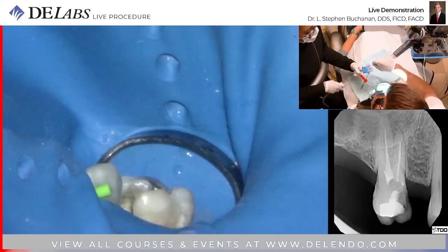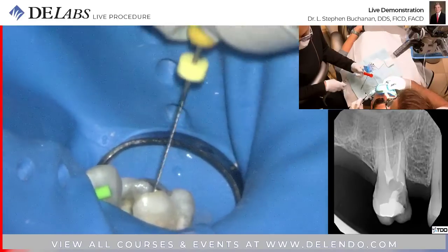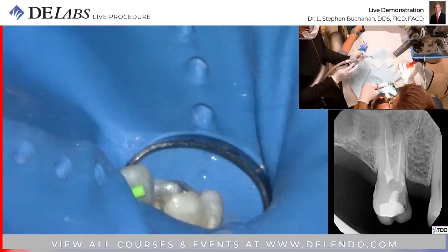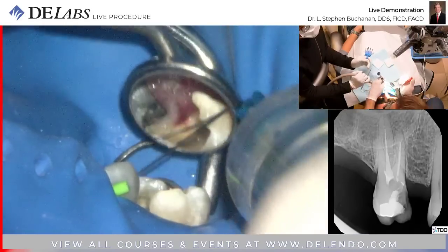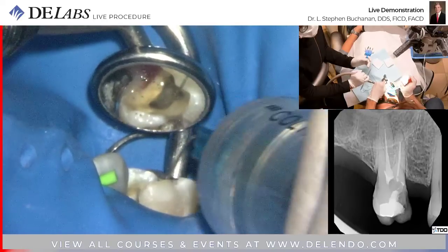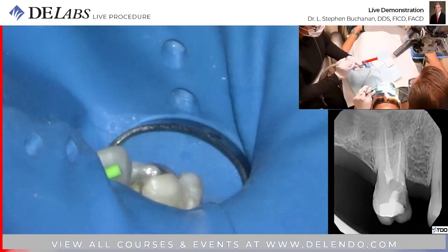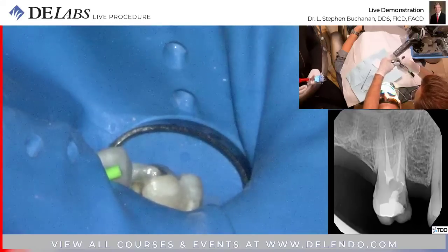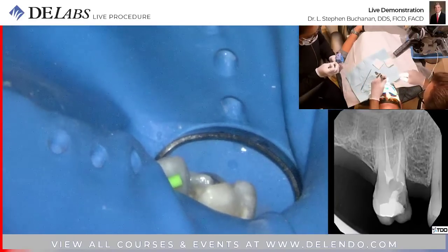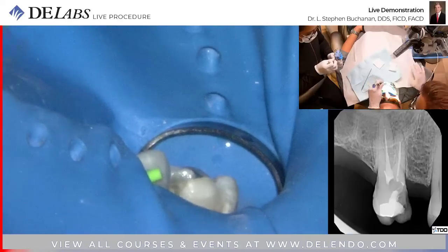So the palatal canal is taken care of. The last instrument in a canal is the patency file. I'm going to drop through there 1 millimeter, make sure there's no flocculent debris there. Okay, let's gauge the distal buccal. It's going really great. Don't wake up, but.